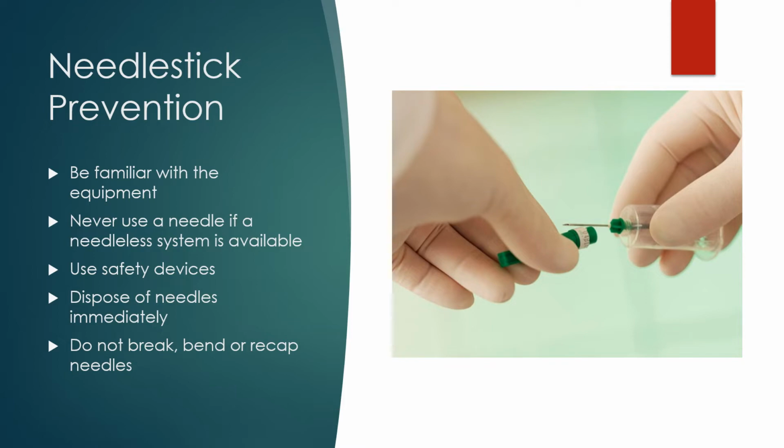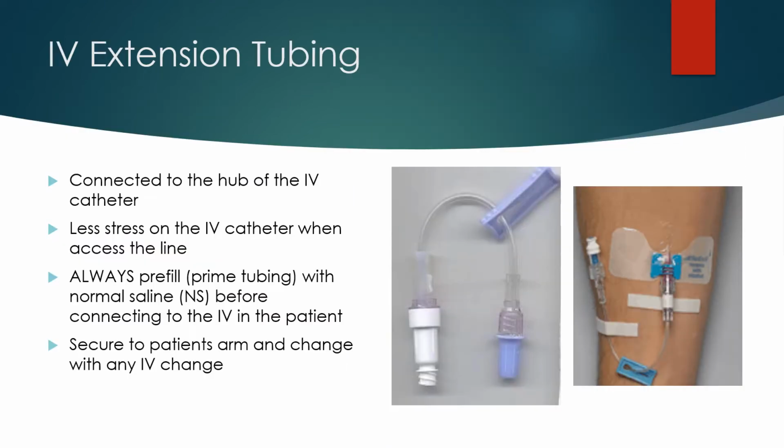We typically always use a needleless system. That's what these IVs are that we're putting in. They're called that because once we poke our patient, we pull that needle out and just leave the catheter in place. So we don't have to just keep sticking them every time. Everything else will be attached to that system.